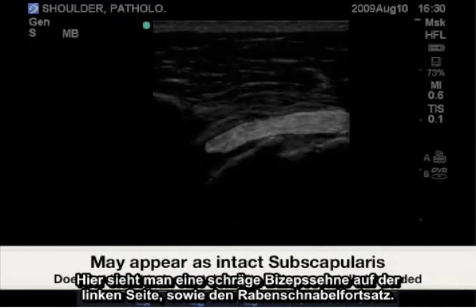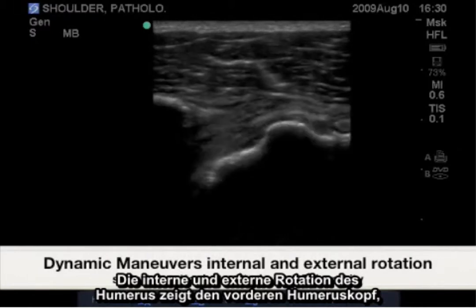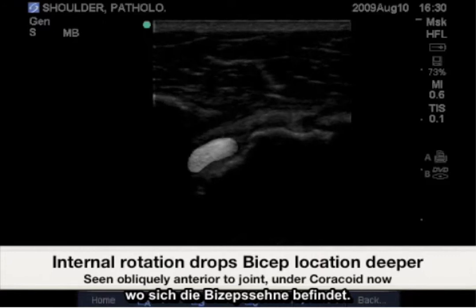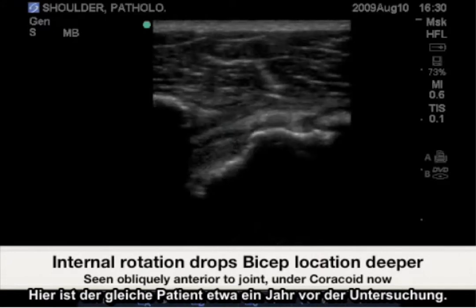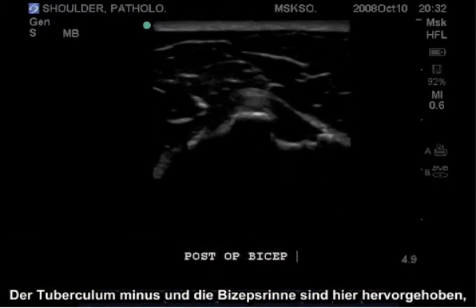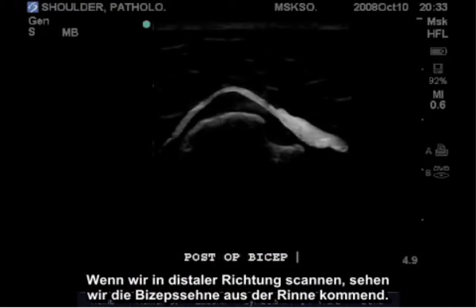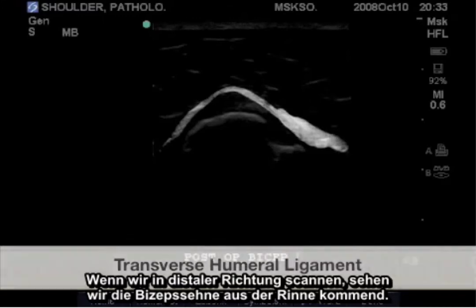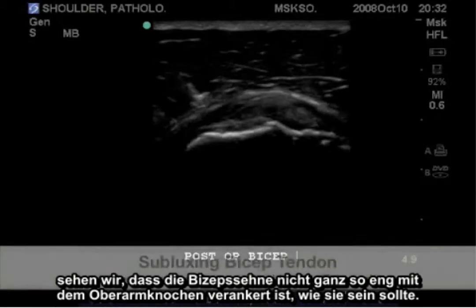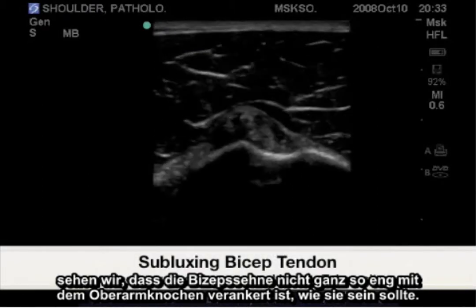Here we have an oblique bicep tendon on the left, also the coracoid process. Internal and external rotation of the humerus will show the anterior humeral head where we have our bicep tendon resting. Here we have the same patient approximately one year prior to the exam. Highlighted is the lesser tuberosity, the bicep groove, and the transverse humeral ligament. As we scan distally, we see the bicep tendon subluxing out of the groove, and scanning even more distally, the bicep tendon is not quite anchored as closely to the humerus as we would like to see it.